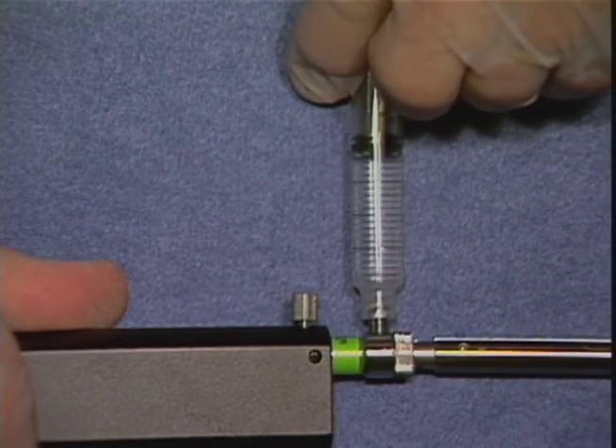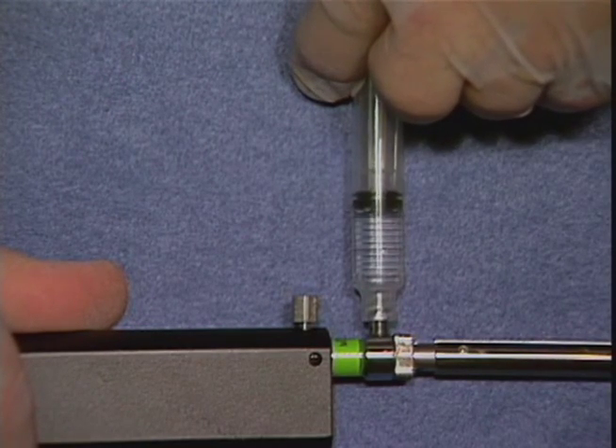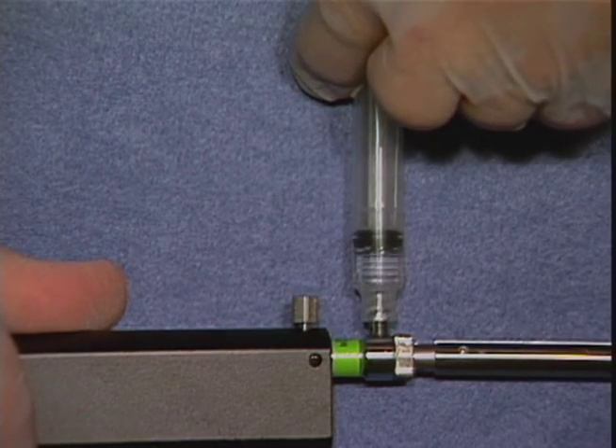An additional feature on model BML 3Q is the ability to infuse contrast medium through the lure lock fitting.